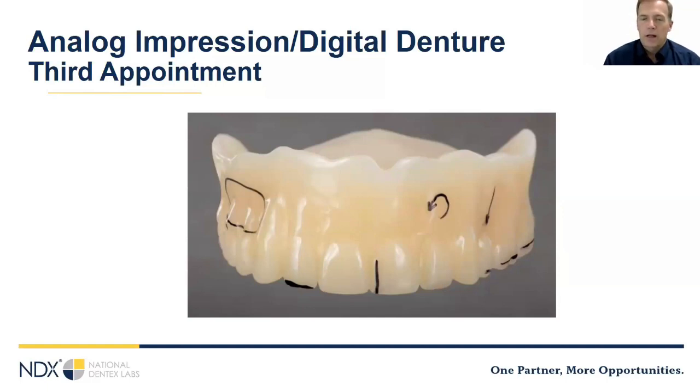You can see in this photo, there's been some good information provided to the laboratory to be able to change the case. So not only can you make notes on your prescription, you can actually show the lab what changes you want on the prosthetic. Huge changes, you may want to do another try-in just to make sure that they've been done predictably. If you're making small changes like this, most of the time you can go straight to finish.